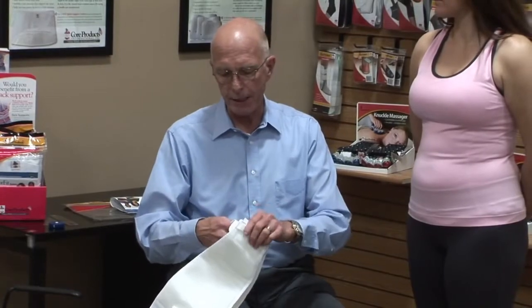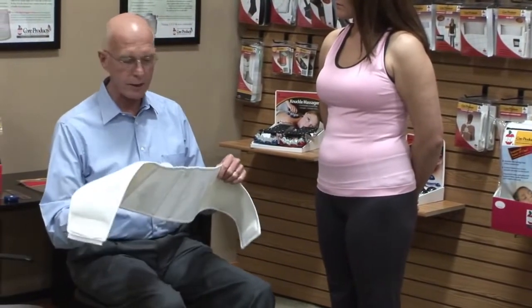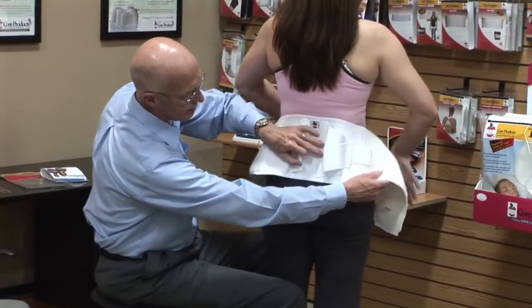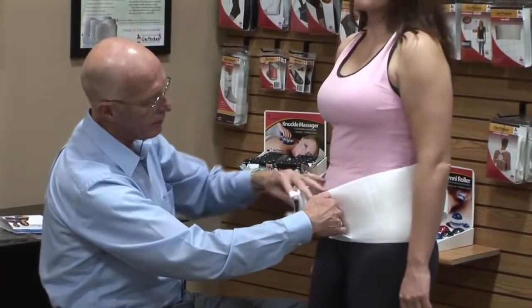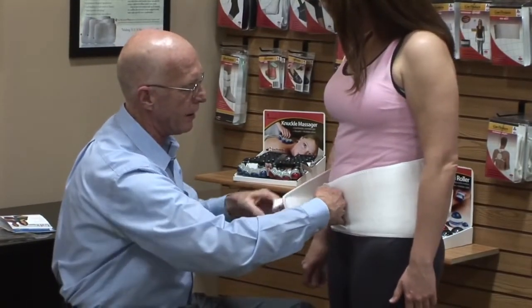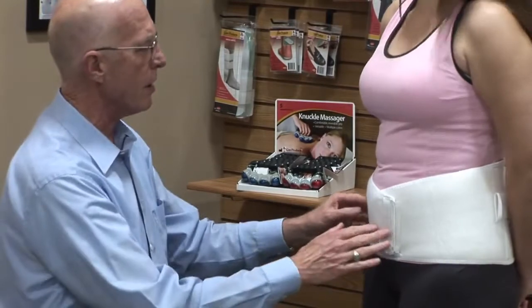This device has hand loops. We open the product up and I'll fit it to the patient — it won't offer the full compressive support that it will when she puts it on herself, but I need to teach her the process. We start with the back: the bottom of the support should come right to the top of the crease of the buttocks at the distal margin of the sacrum, centered on the spine. Then we do the anterior closing, with the bottom of the support at the level of the symphysis pubis.